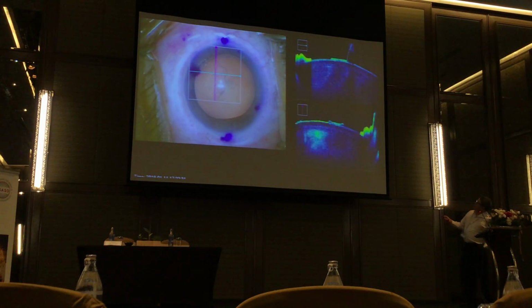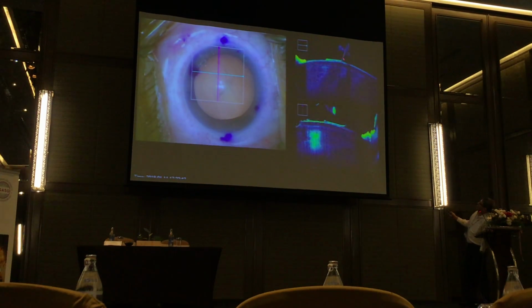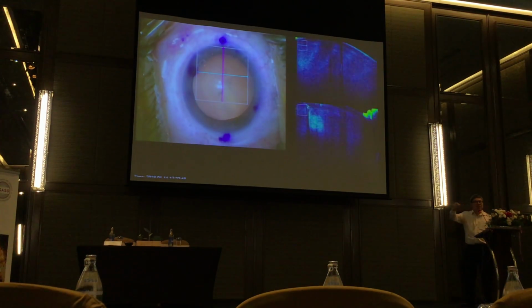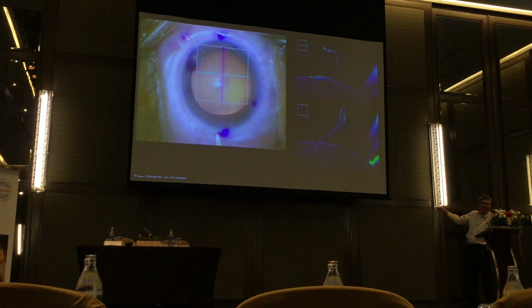Now yesterday, I wanted to show this clip because we did capsulorhexis and some of you had difficulties at some stages. One thing we never think about is when you have a capsular flap there, you can see how much it's standing up. Where do you hold that flap? Remember some of you were pulling the elastic flap. You didn't have room, there's no anterior chamber left for you to work with. Why? Because you see how far up the capsular flap can stand. You can't tell from that.